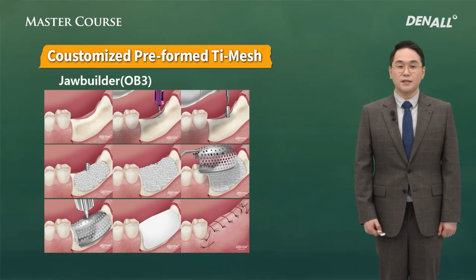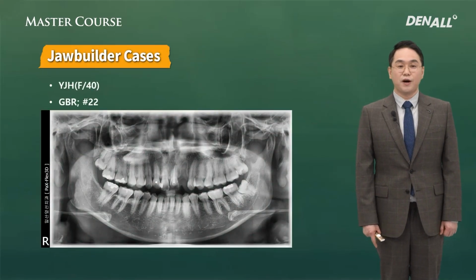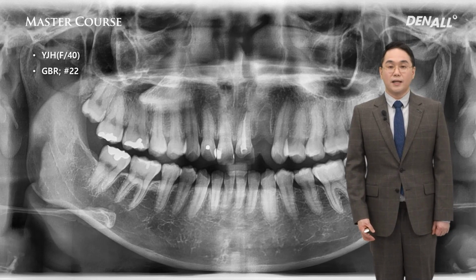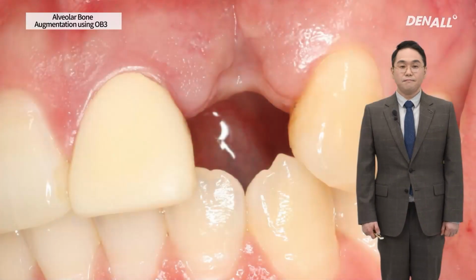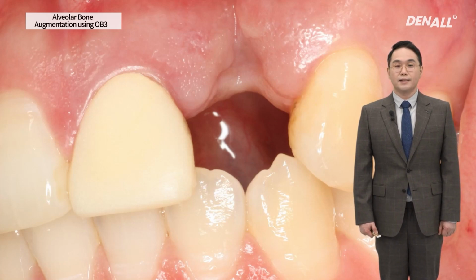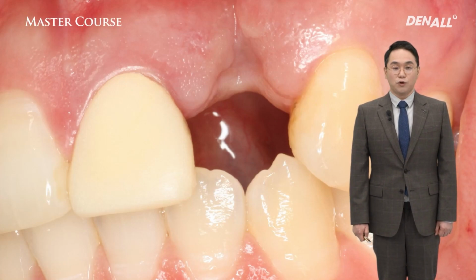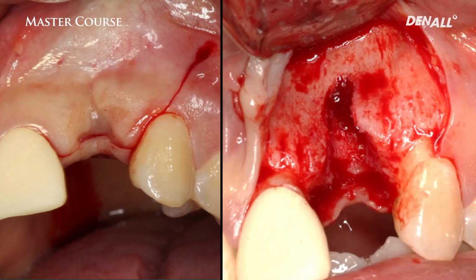Let's look at a case of how it is used clinically. A 40-year-old female had a traffic accident, so the upper left incisor was extracted. Due to the trauma and the extraction, there is a severe labial bone resorption. In the pre-op photo, as you can see, the adjacent teeth papilla looks okay, but the labial bone plate is lost a little bit. She wanted a highly aesthetic implant prosthesis, so we decided to use the delayed approach.